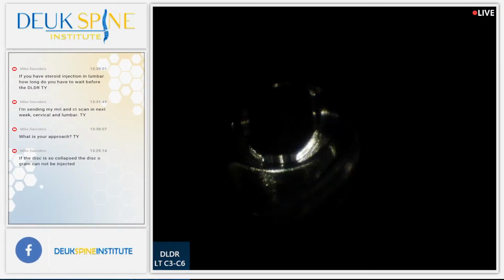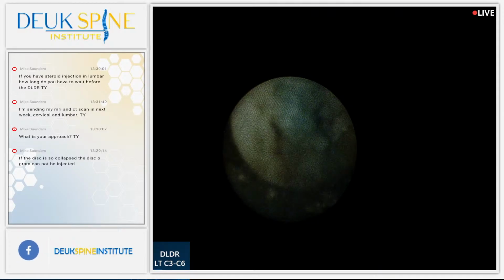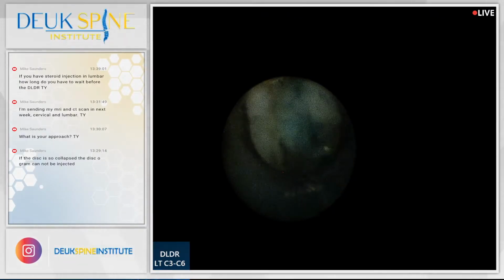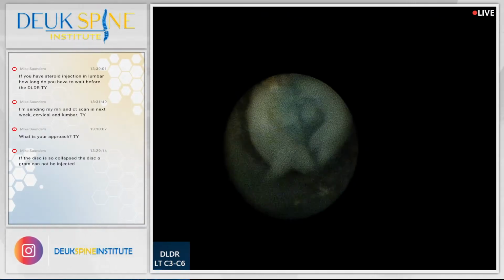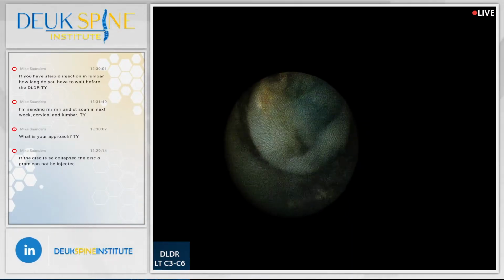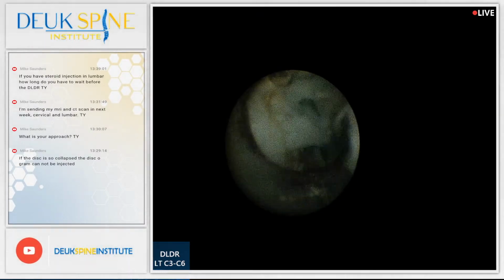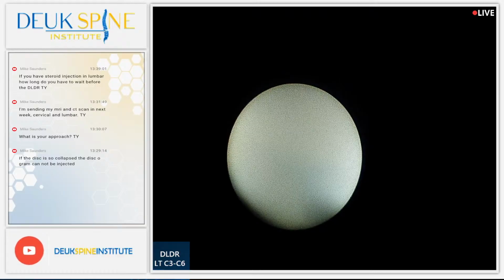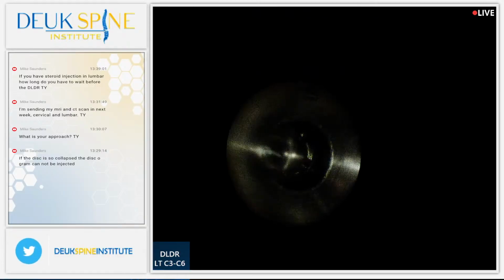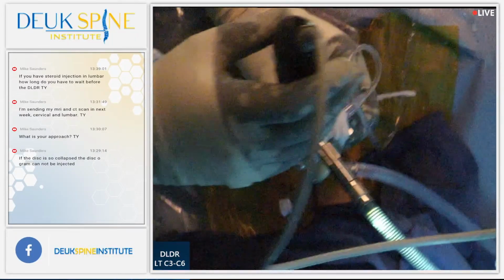I don't know yet. Every time I go back in, I keep hitting the fiber. I don't know if it's just so zoomed in, the view. It may also be the shape of the fiber, right? Guys? The shape of the fiber tip. You understand what I'm saying?